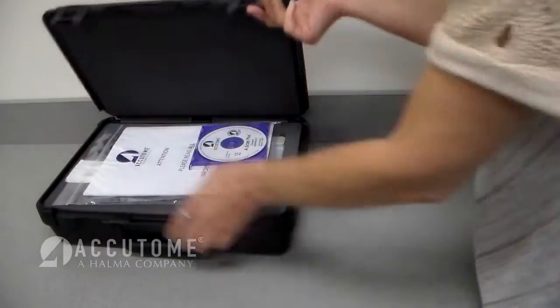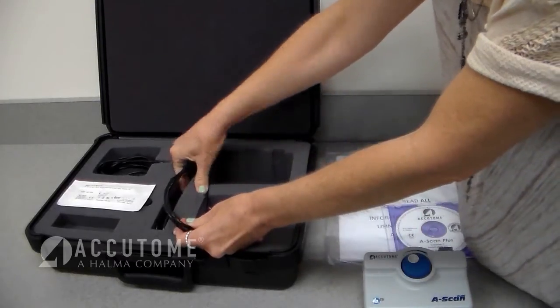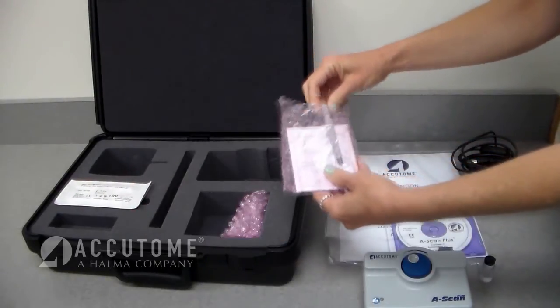Inside the carrying case you'll find instructions, installation software, the ASCAN Connect control unit, USB cable, foot switch, test block, probe, and immersion shell.